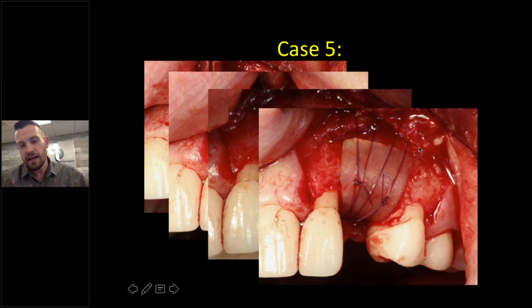I utilize a lot of retraction for this, and some of the retraction that I use, I'll just utilize the side of it to place the sutures off, so that I can then put the membrane in and then go straight to slinging or to tying the sling. So to answer your question, Frank, no, it will spring back on you. And that is a drawback.